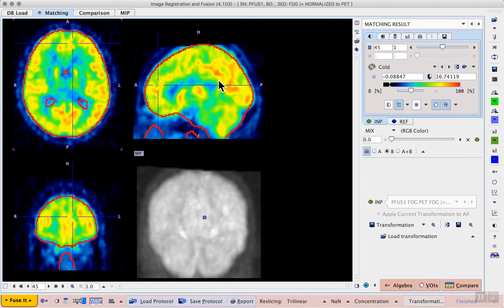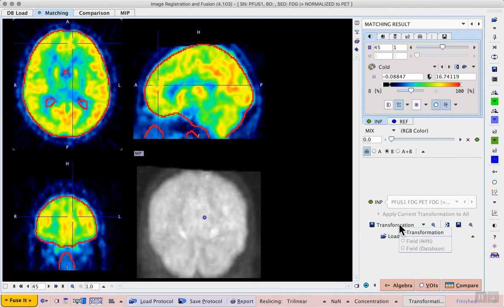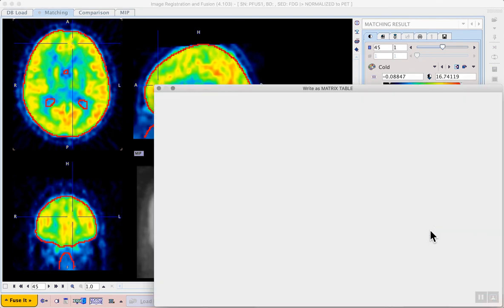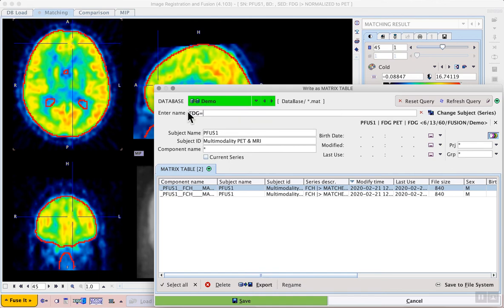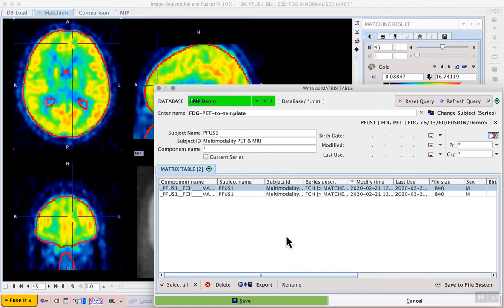Assuming that I'm happy with the transformation I can save it to the database in case we need to do the calculations for this dataset again. So I can use the save transformation icon on the right hand side where I can save this transformation for example as FDG PET to template so that I can access it easily later on.